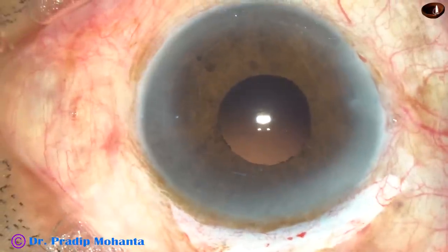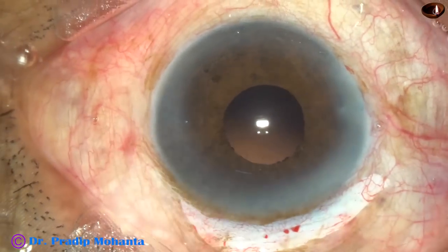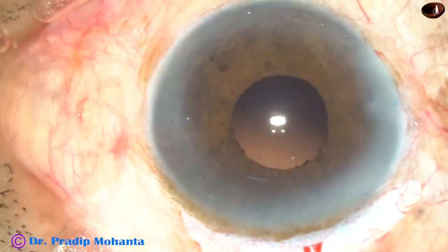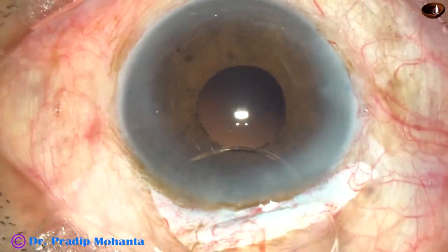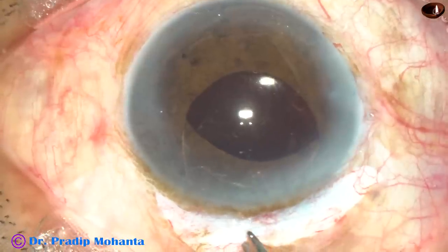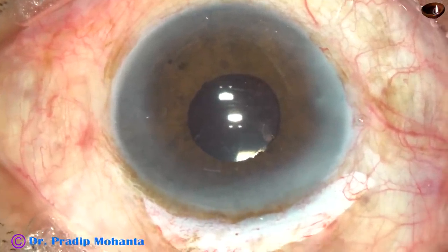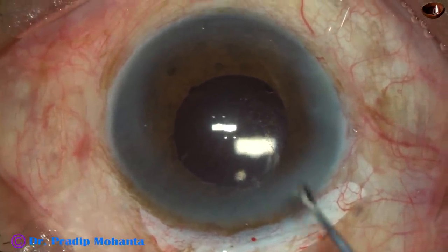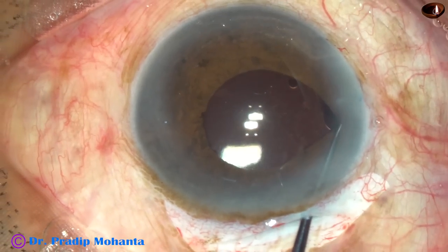Some more visco is injected and the intraocular lens is to be placed in the capsular bag. Hold the lens with McPherson's forceps near the trailing end — hold the optic near the trailing end. Gently lift the anterior lip of the main wound. Use both forceps and go in — the leading haptic should go into the capsular bag. Then use only the McPherson's forceps to depress the trailing haptic into the capsular bag. Check with the Y-instrument that it has gone into the capsular bag — yes, it has.